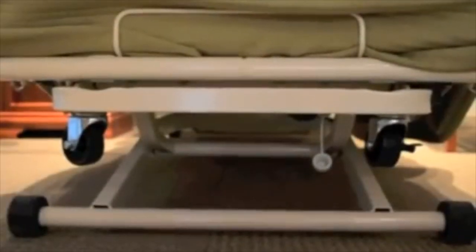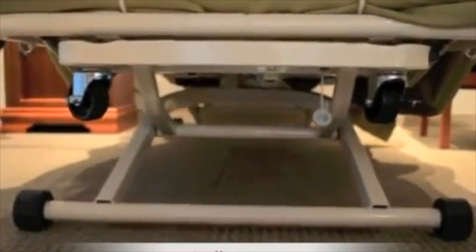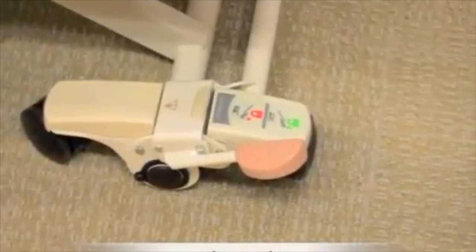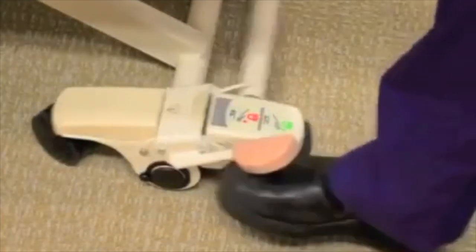The first is roll in low, which means the bed is always locked unless a caregiver lowers the bed to where the wheels touch the ground. Roll at any height means the bed will roll at any height unless brakes are applied. Brakes are known as UltraLock and can be located at the foot and/or head section.